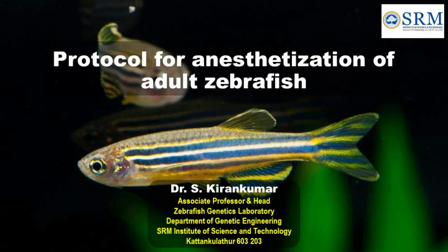I am Kiran Kumar, an Associate Professor in the Department of Genetic Engineering, and today I am going to present to you a demonstration video on the protocol for anesthetization of adult zebrafish.